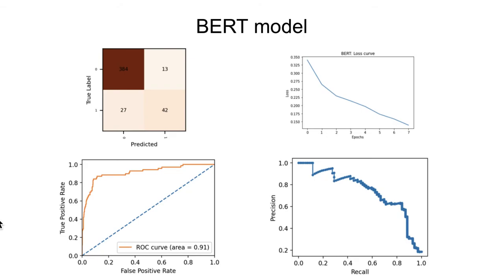To look into that deeper, we note these performance metrics. In the medical world, we often want sensitivities above 90%. That means we're catching 90% of the positive cases. So in this precision recall curve, we can see that we want to be in this region here. However, that means that our precision would be around 50%. That is, half of our positive calls would be wrong, but we would still get 90% of the positive cases.